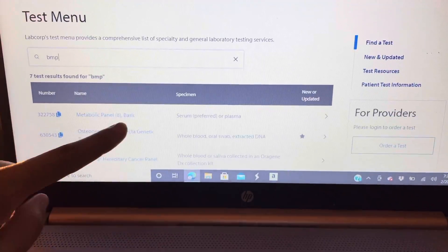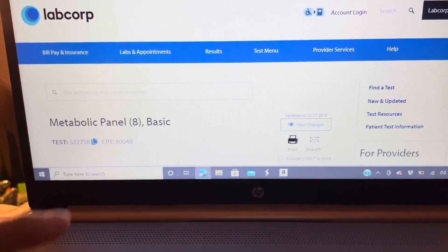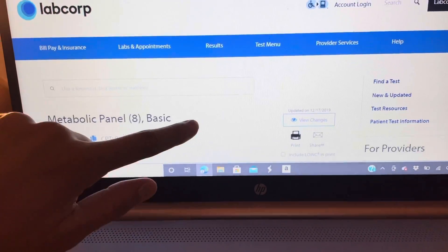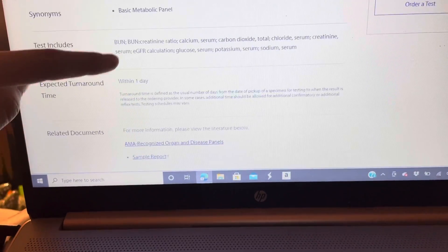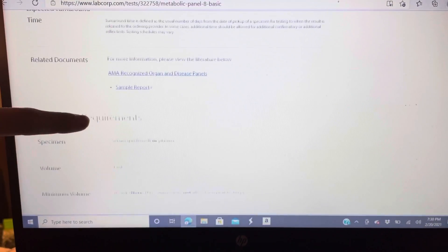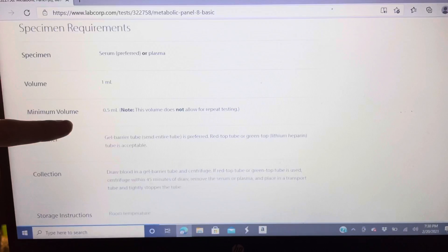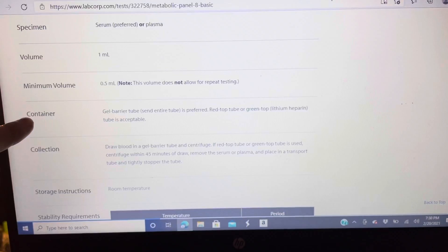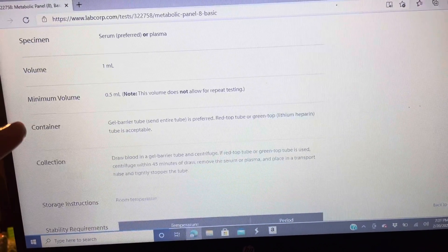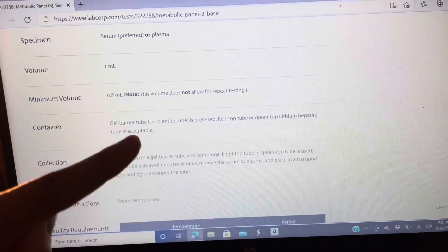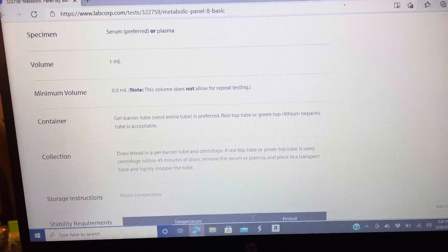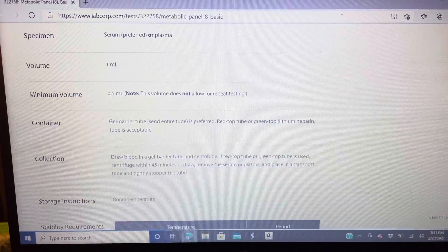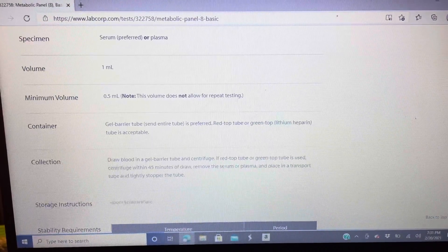I'm just gonna press enter, it's the first one, BMP, so I'm gonna click on that test: metabolic panel, basic. I'm gonna scroll down. It gives you all the information regarding this test and the specimen requirements. Now you're going to go to container, so we're gonna scroll down all the way to container type, which tube to draw the blood in. Container gel barrier is preferred, so they prefer most labs prefer an SST tube like a tiger top tube. Or you can use a red top tube or green top, that's acceptable too, but they prefer a gel barrier tube.